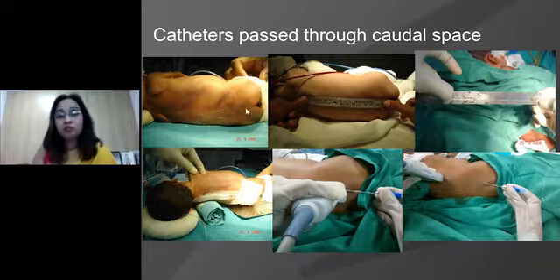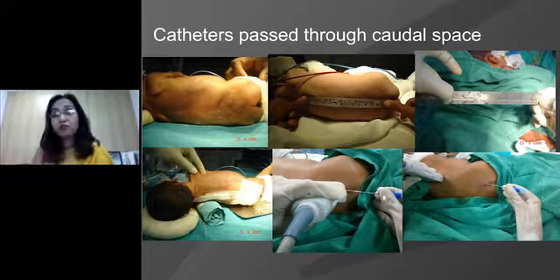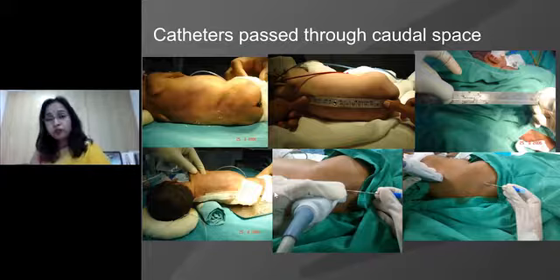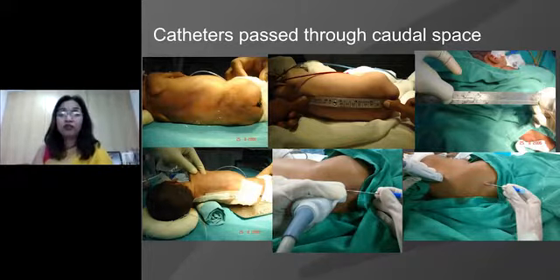Traditionally, how we did it was we palpated the caudal space, and then we understood that maybe the incision was here. So we actually measured the distance, and if the measured distance said that this was 14 centimeters from the caudal, we pushed the catheter from the caudal 14 centimeters from the skin, assuming that the catheter indeed has reached where the tip is supposed to be, so that we give an absolute site-specific analgesia.